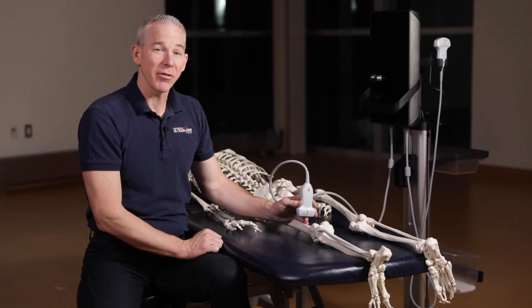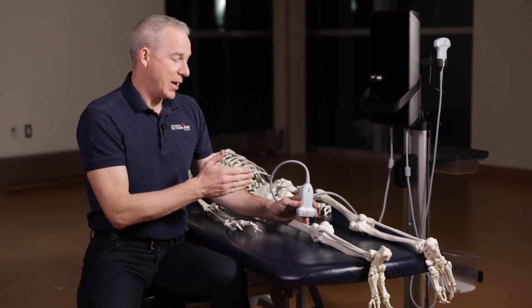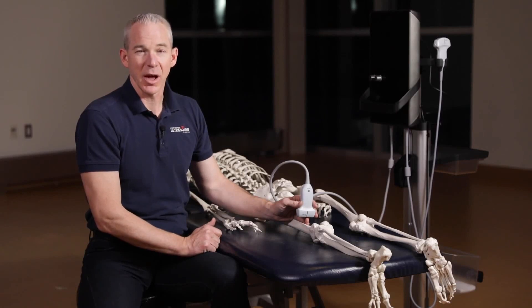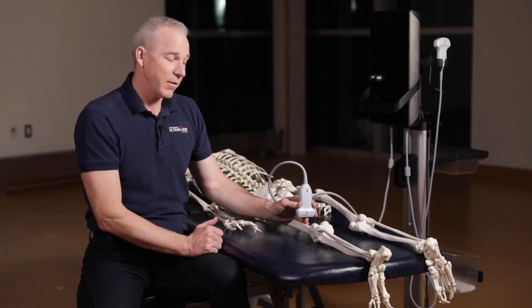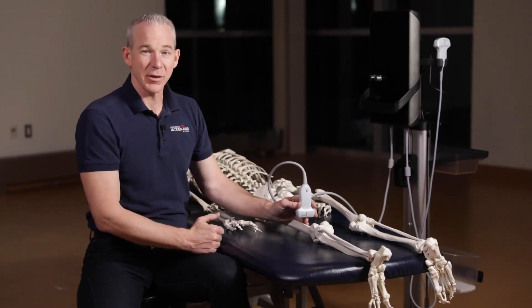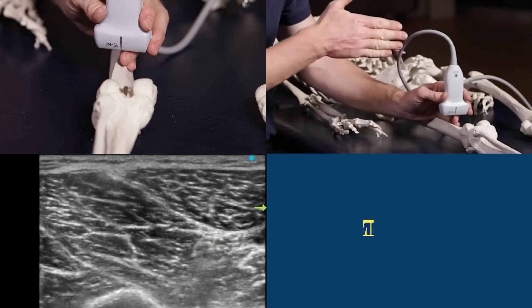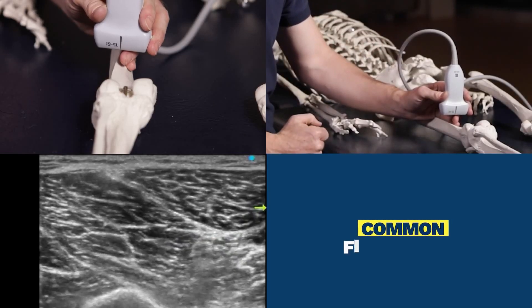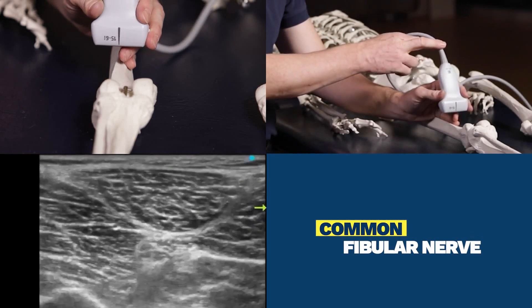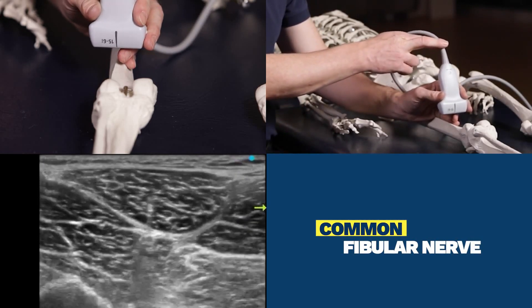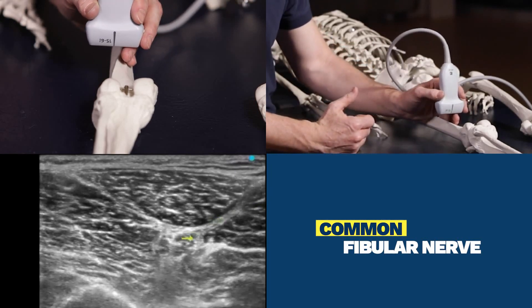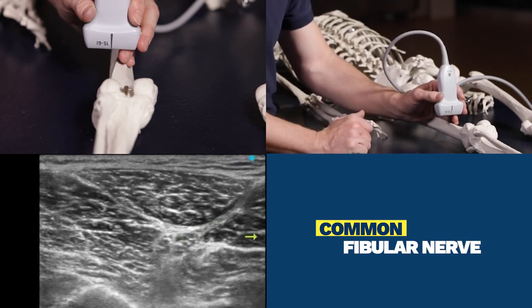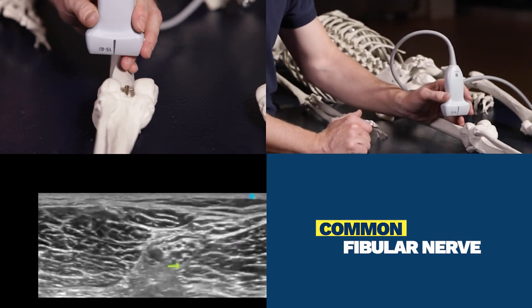Here we're going to pick up where we left off with the sciatic nerve at the location it bifurcates to become the tibial nerve and the common fibular nerve, previously known as the common peroneal nerve. The orientation of the probe is going to be transverse on the femur. The landmark is going to be the posterior femur. The movements are going to be angling until we can see the femur bright, but we also want to angle until we can see the sciatic nerve nice and bright. We then move the probe or slide distally until we see a bifurcation.